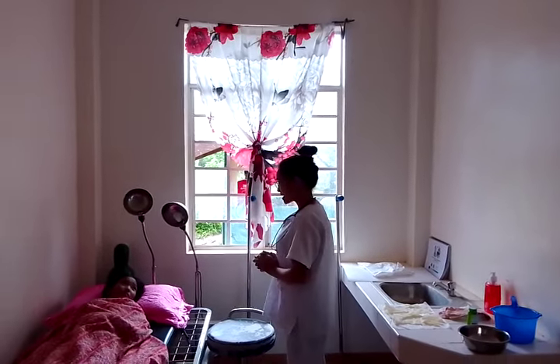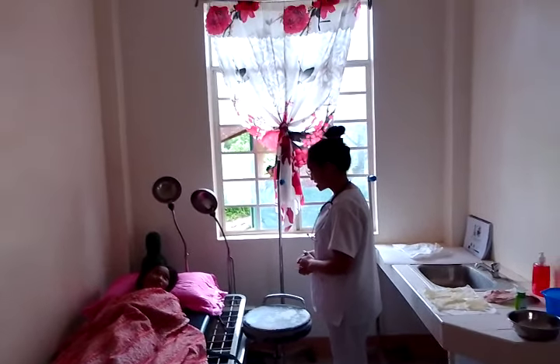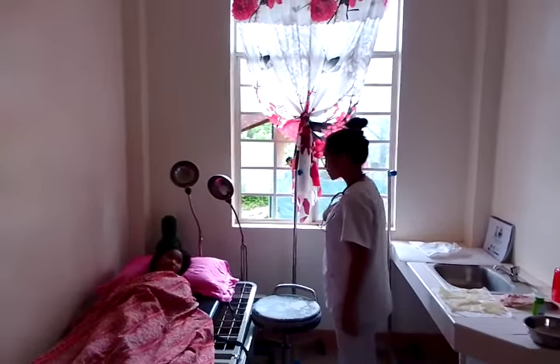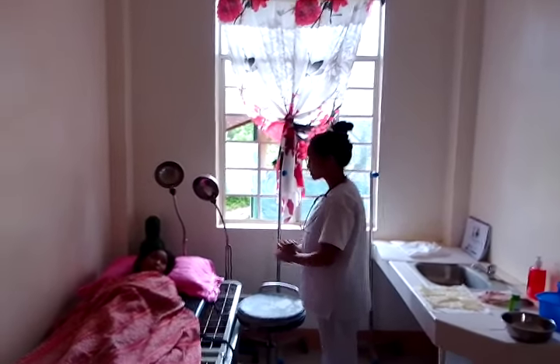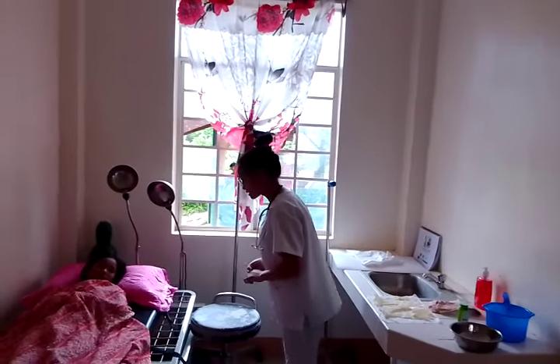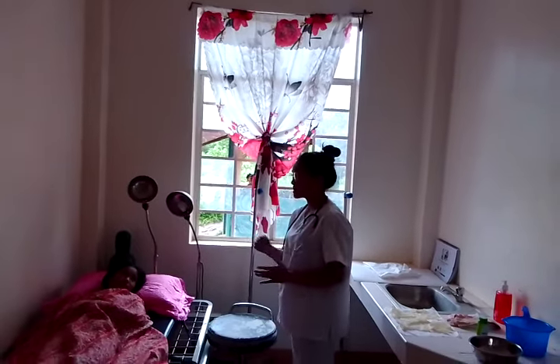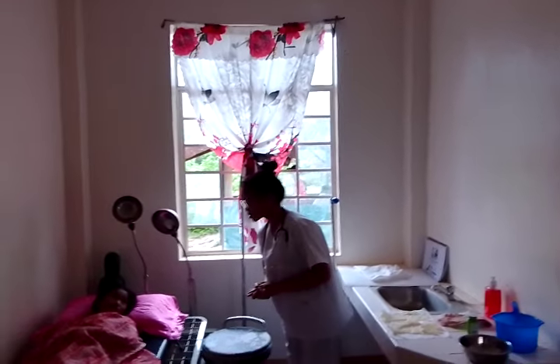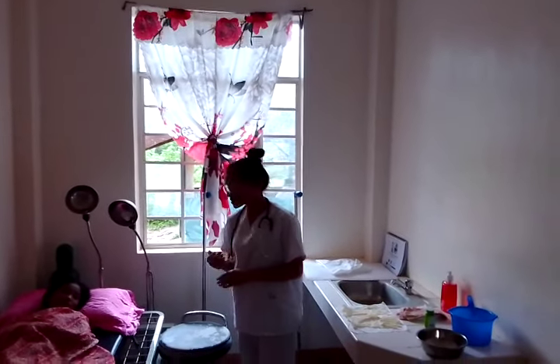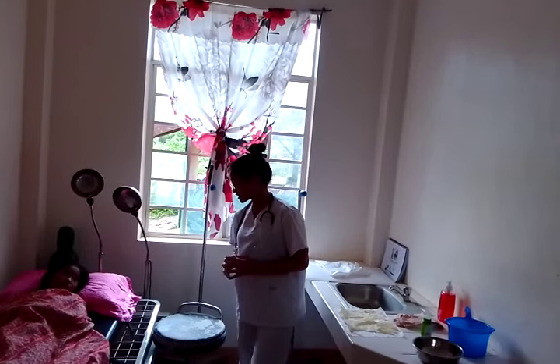Good morning, ma'am! I am your nursing assistant for today. We are going to provide catheter care for you. A female catheter is a small sterile tube that is inserted through your urethra to drain urine from the bladder. Are you okay with that, ma'am? Okay.